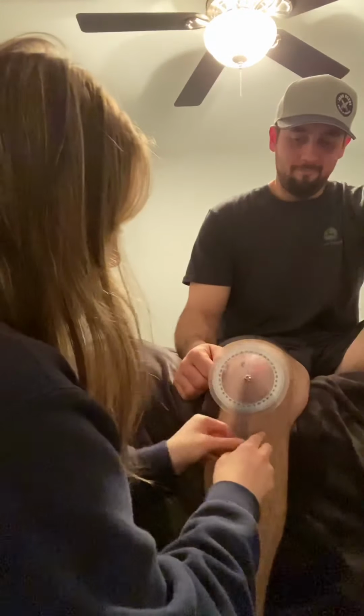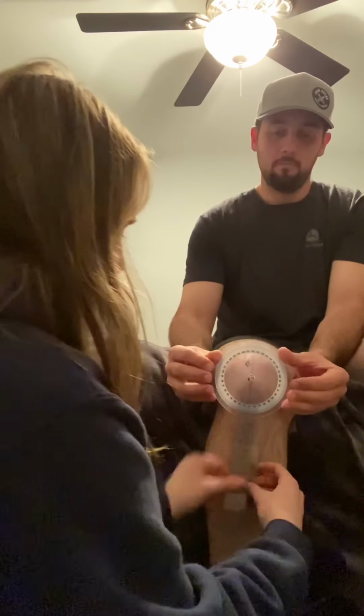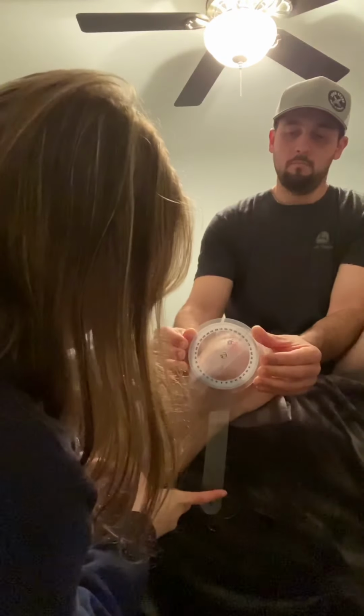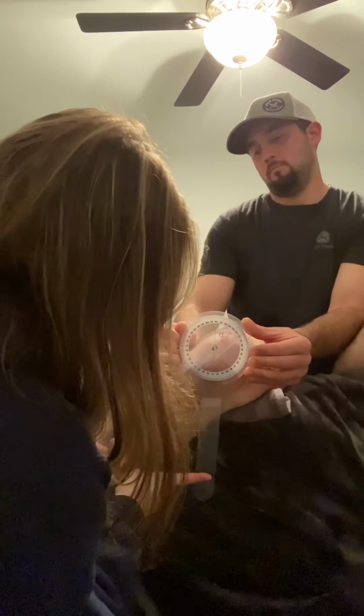And we're going to come here. Same landmarks, so line up. I'm going to have you hold again if you don't mind. And then we are going to move that leg out into hip internal rotation. We are going to be at 44 degrees of internal rotation.